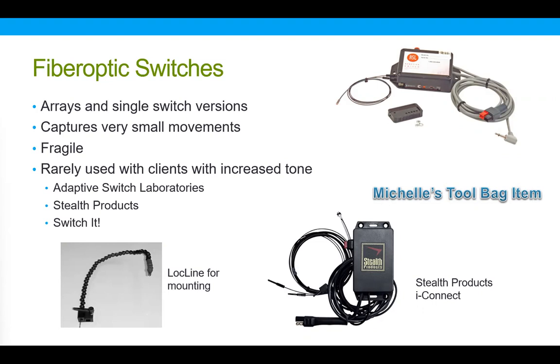There's a cable that's attached here to the main controller, and that cable is often 2 separate cables, and those cables might be housed in a single wrapping, but a fiber optic beam of light shoots up one cable to a terminus, the end of this cable. Let me get my arrow there. And then it is reflected back by something it sees in its path, like someone's finger. And when it is reflected, the light goes back down the second cable, activates the switch. But this is very fast technology. A lot of our internet or cable is through fiber optics. It's very quick.